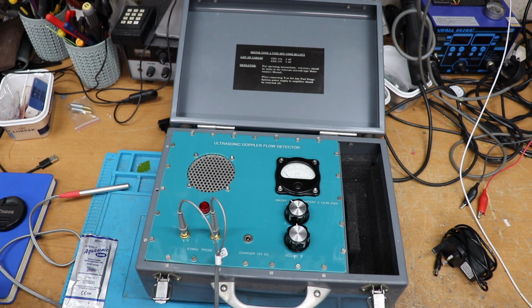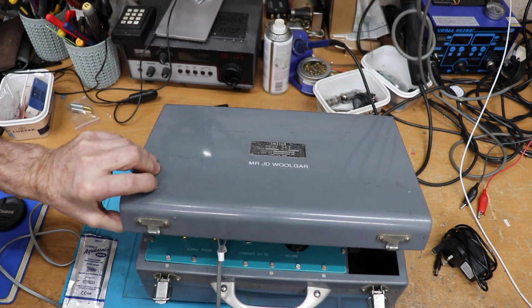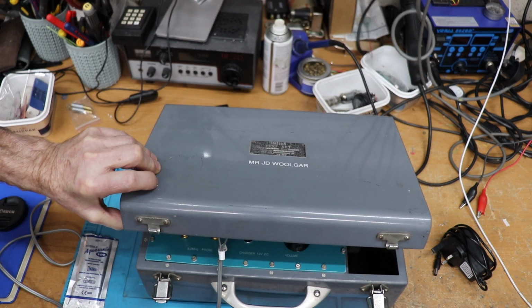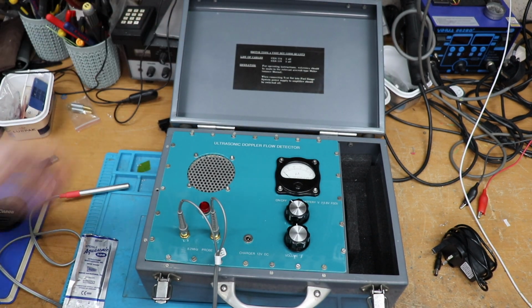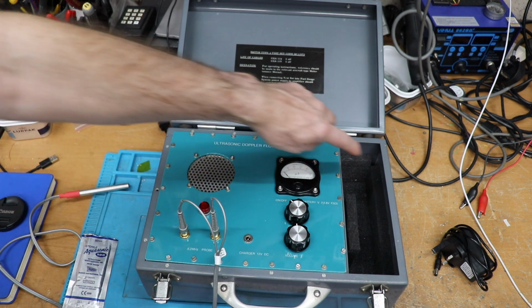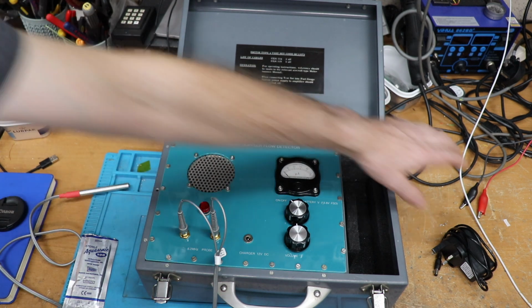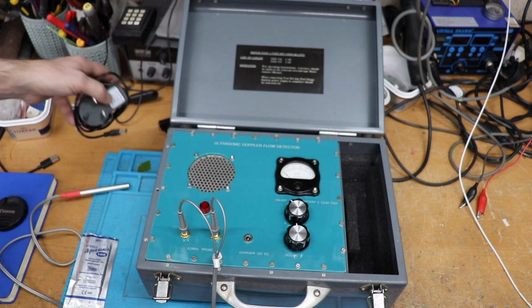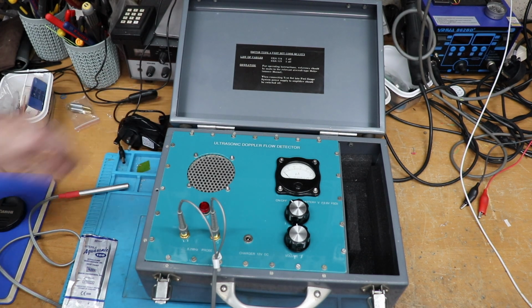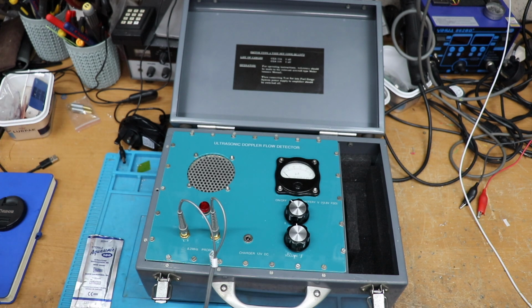What I did is I built all this up into a spare box that I had, a test set which came from some old aircraft equipment, and the Doppler machine fits quite nicely in there. I've got another little compartment with some foam to keep the probe in, and there's also a charger, which charges the rechargeable 12-volt battery.